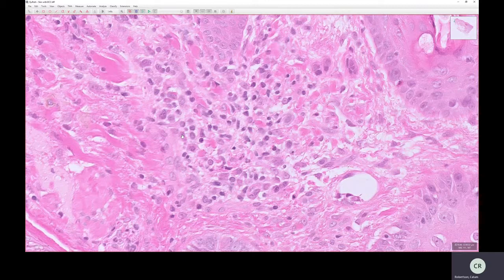Here, we've got lots of lymphocytes in this particular view, and you can identify lymphocytes on histological sections because they're almost all nucleus, in contrast to erythrocytes, which had no nucleus. The lymphocytes are almost all nucleus. There is some cytoplasm within these cells, and on cytological preparations you can sometimes see a little bit of cytoplasm, but on H&E tissue sections, you almost never see it.